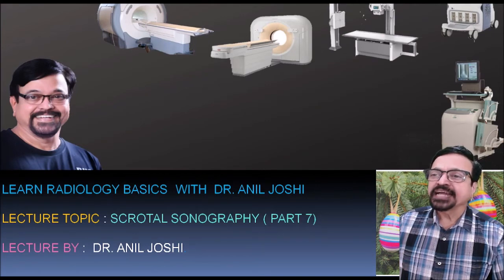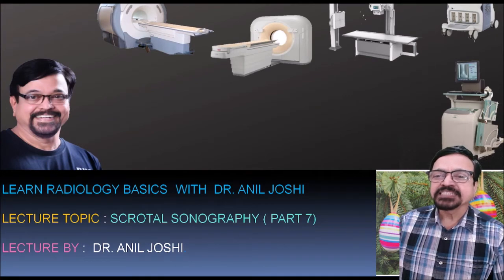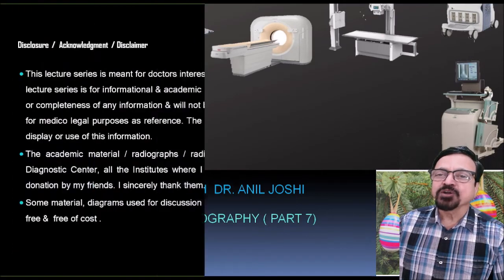In this series we have different topics of radiology, from X-rays, ultrasound, CT or MR, and different series are made over them. The present series is on ultrasound, and more specifically, on scrotal sonography. By itself, scrotal sonography is a big topic. That's why we have divided it into 7 parts. This is the 7th part of the scrotal sonography covering different pathologies.